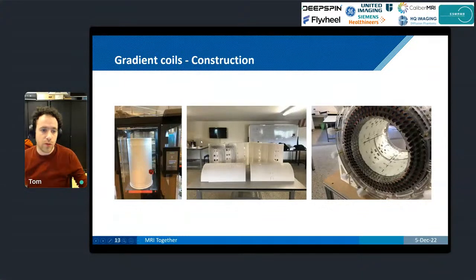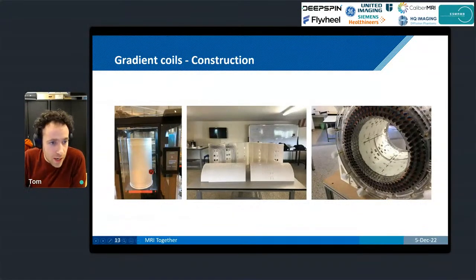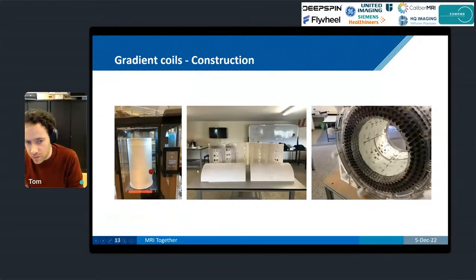And then you want to build your gradient coils because, well, you need to know where to put the wire. Well, you know where you want the wires, but you actually need to be able to put them there. So this is where 3D printing has really come into its forte over the last few years. We're able to print very large structures like the gradient coils. And after cleaning the 3D prints, because they're never perfect, we can just click copper wire into the paths of the 3D print, and then we mount those 3D prints inside of the magnet.